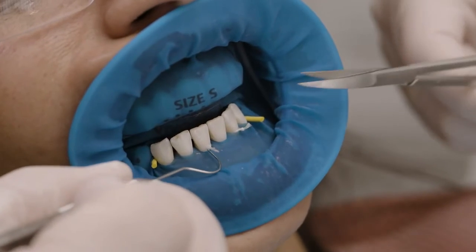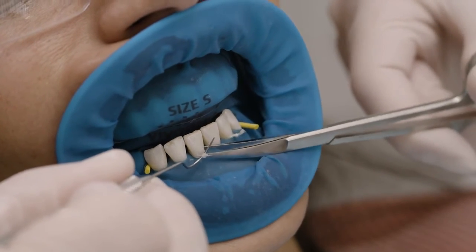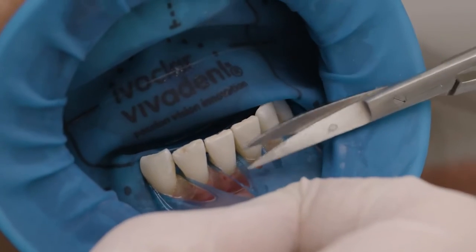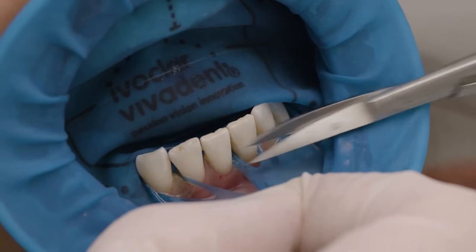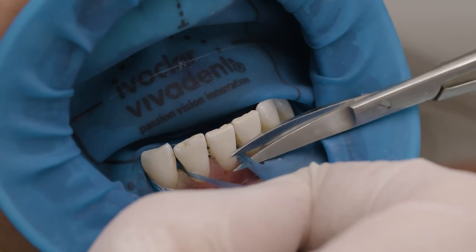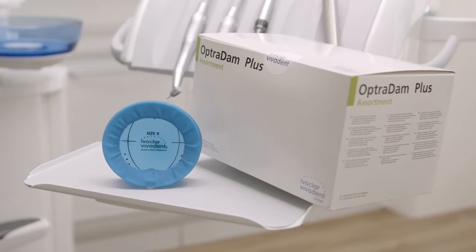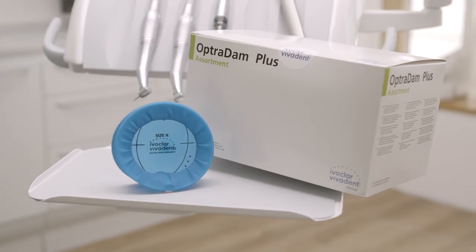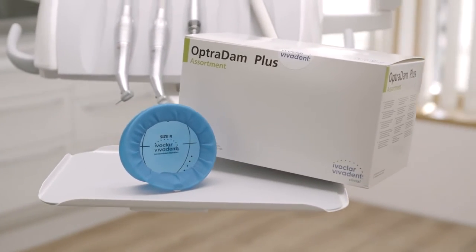After the treatment, the ligatures can easily be cut and removed. Then cut each septum carefully and remove the rubber dam. Optradam – safety and protection for patients, dentists, and dental team members.